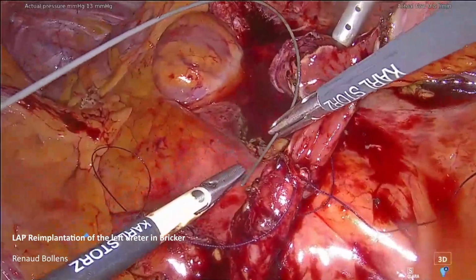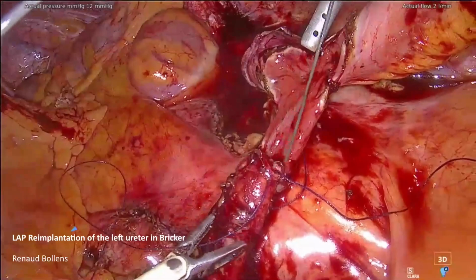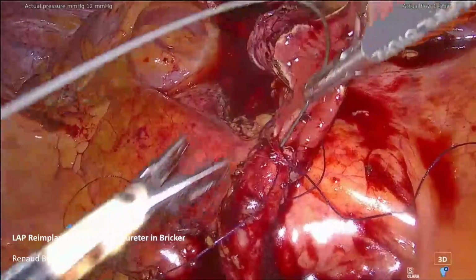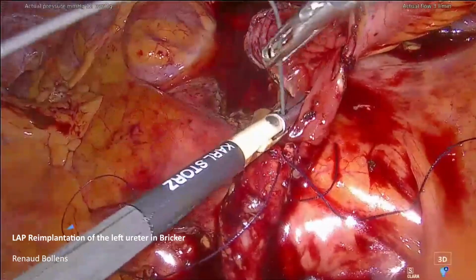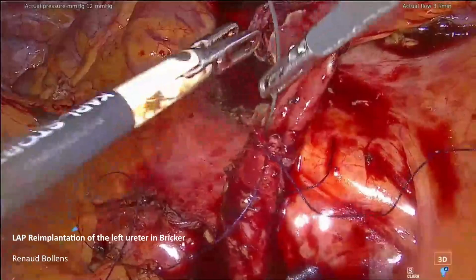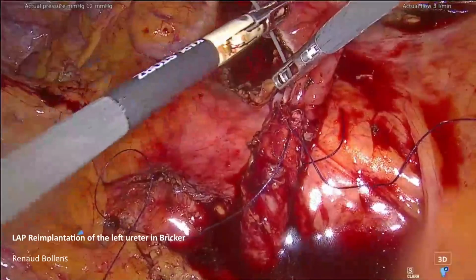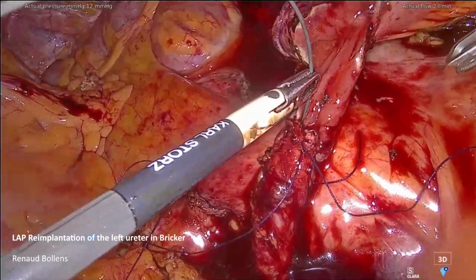And the trick here is to place the guide wire in parallel to the ureter. You see that like that it is more or less parallel, and then with one hand, I can enter the guide wire inside. Okay, give me the baguette. You can give me the double J. I will place the guide wire inside, and I just have to make the tube.